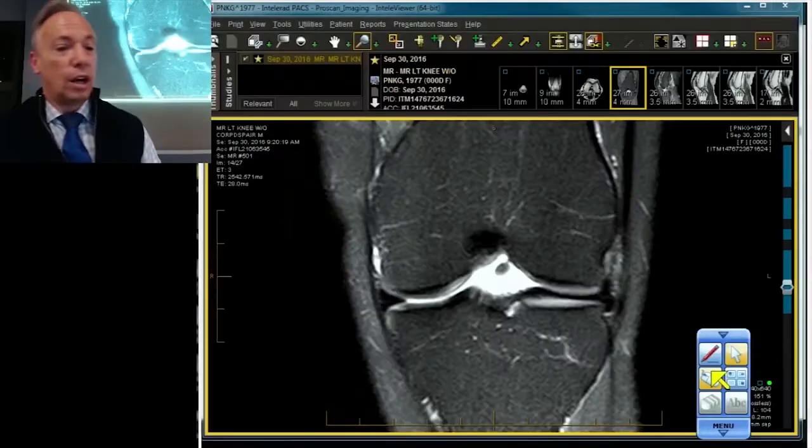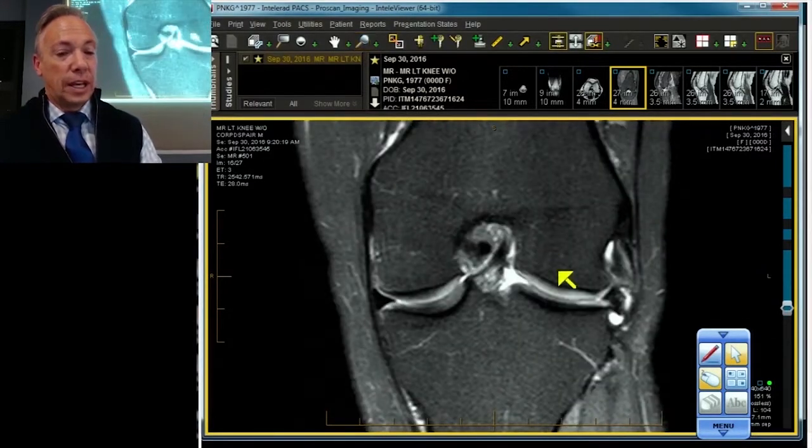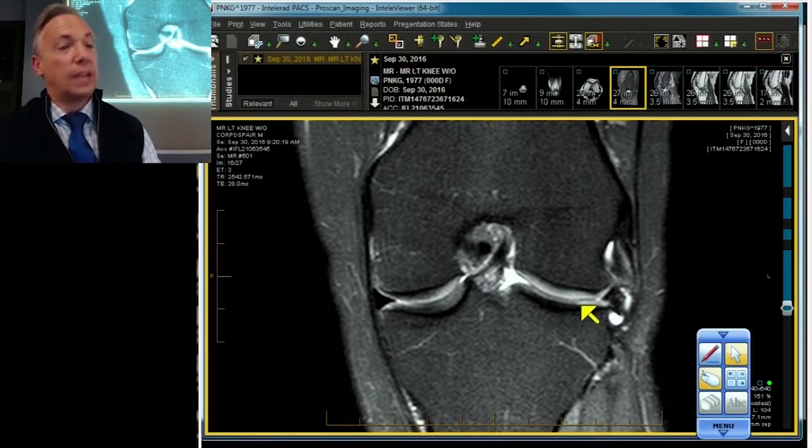Let's take a quick look. Here's exactly just that. Here's our meniscus, and our meniscus is truncated. We'll get to that in a moment. You already know one cause of truncation is a bucket handle tear, but not the case here.